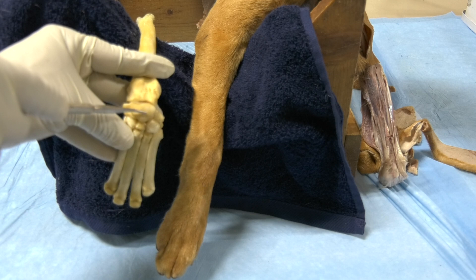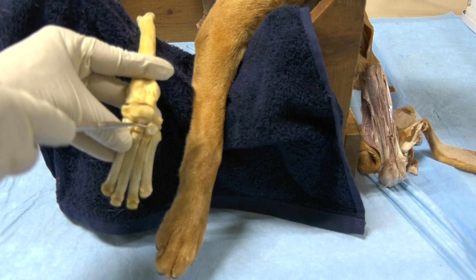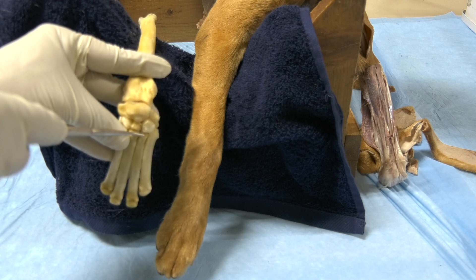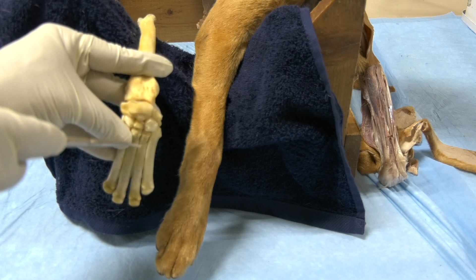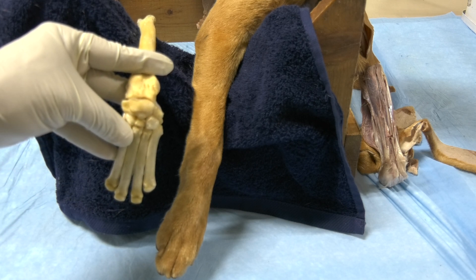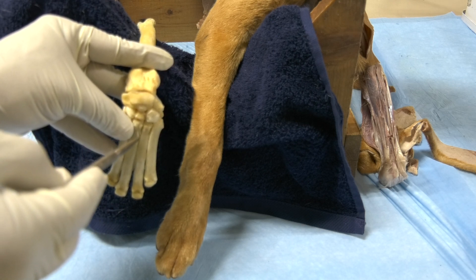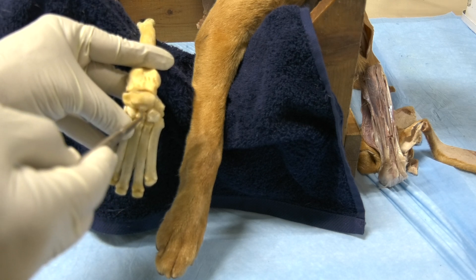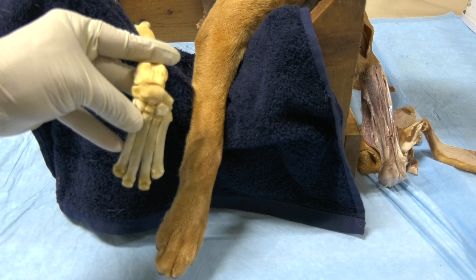Again, three levels of articulation: antebrachiocarpal, midcarpal, and carpometacarpal. For the midcarpal and the carpometacarpal, we do only one injection at the level of the midcarpal. We go in between the third and the second carpometacarpal bones and we inject over there.